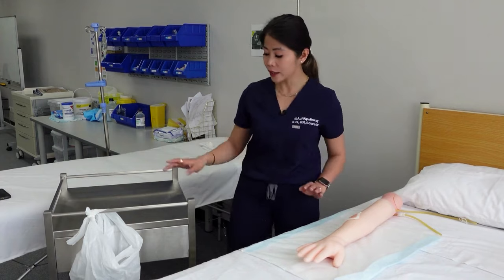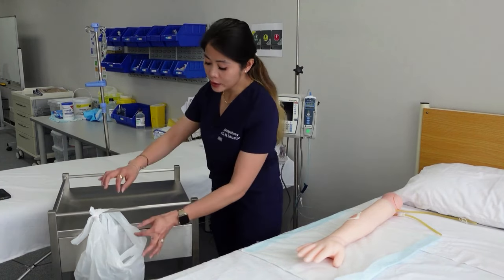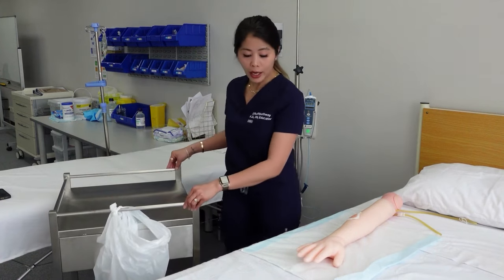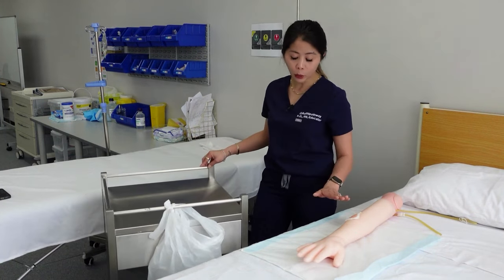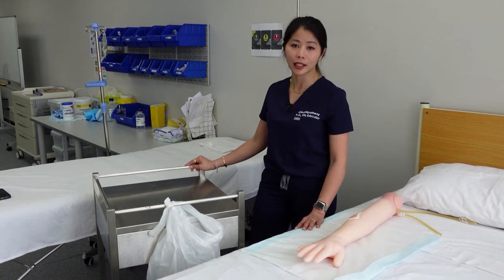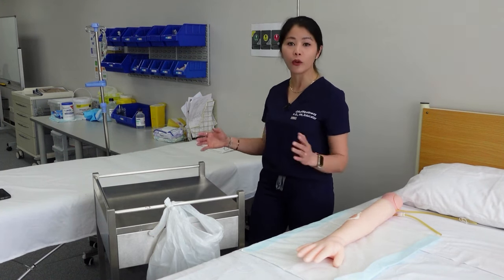The other thing to consider is the placement of your bin. It has to be closer to the wound itself because we want to practice aseptic non-touch technique, making sure that we're not crossing over.